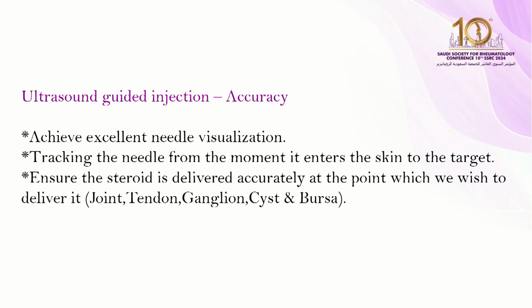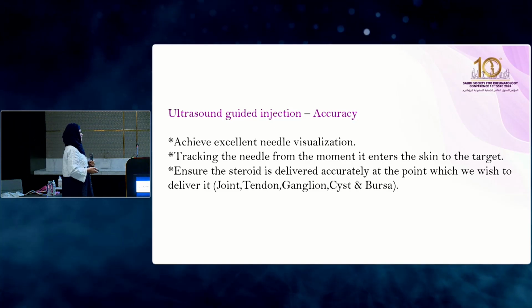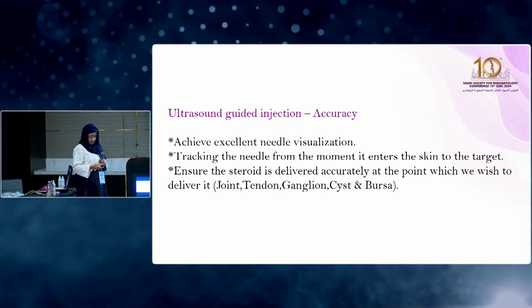For the ultrasound guided injection, we already had a hint this morning that it is more accurate than the blind injection. It achieves excellent needle visualization, tracking the needle from the moment it enters the skin to the target, ensuring that the steroid is delivered accurately at the point which we wish to deliver it, like a joint, tendon, ganglion cyst, or bursa.